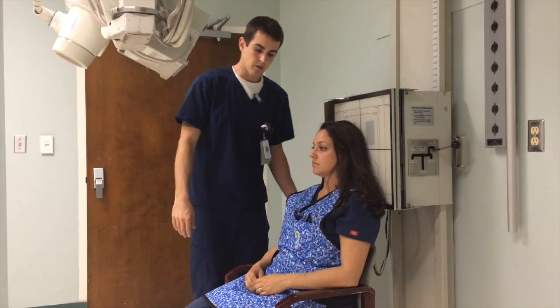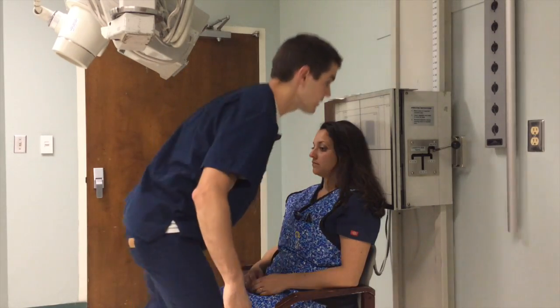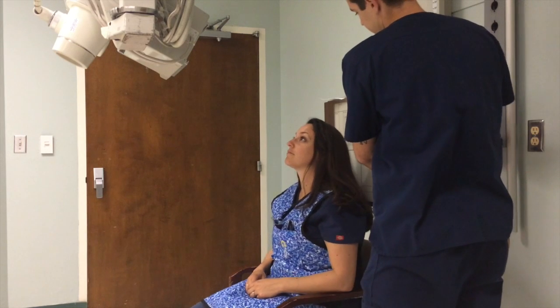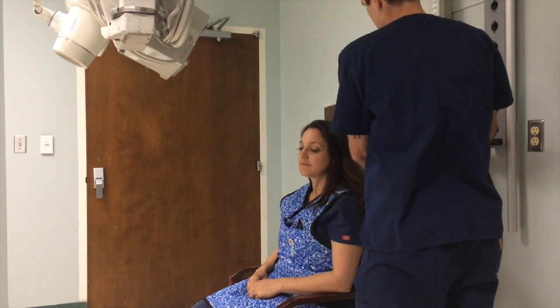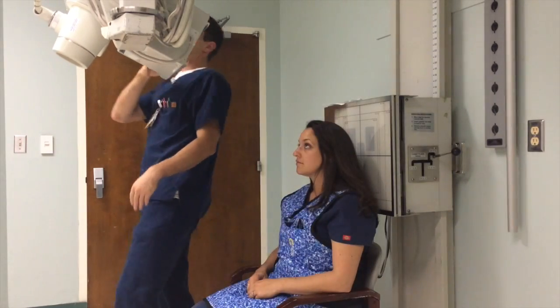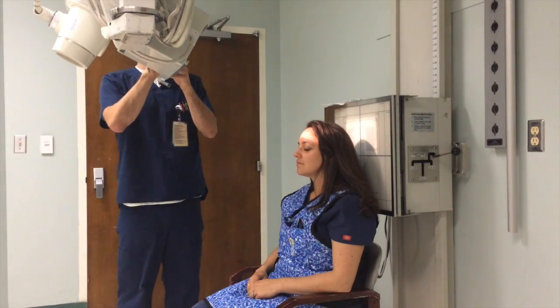So the first thing we're going to do is get our CR centered. There, just want to close your eyes really quick.